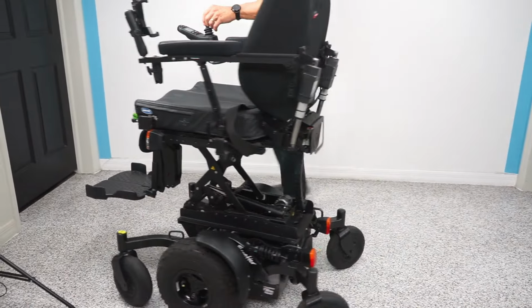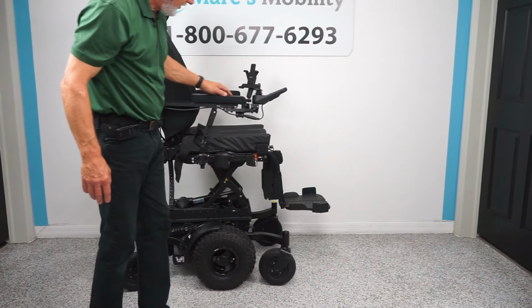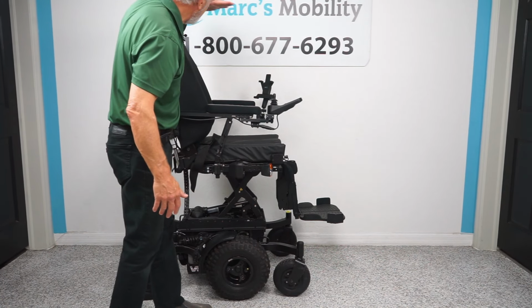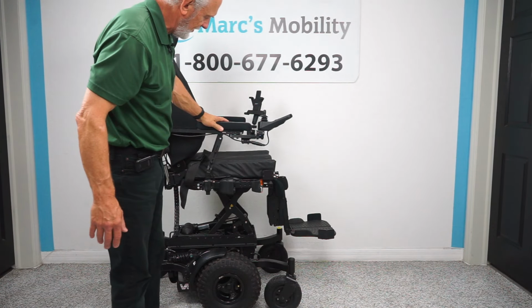So if you're gonna drive with the seat elevated, folks, you know, just do it in nice areas. If you drive with the seat elevated, you're going to be eye level with someone. So someone's sitting in the chair and you're walking with them, you're going to be eye level with them, okay?